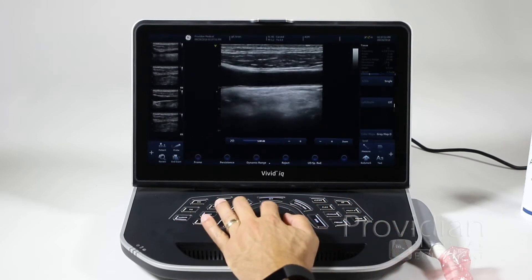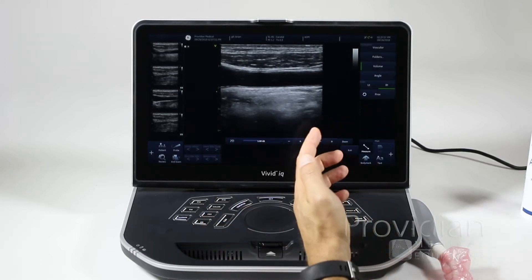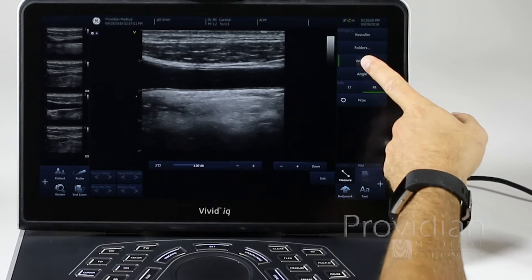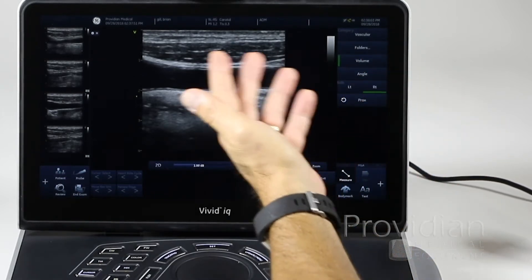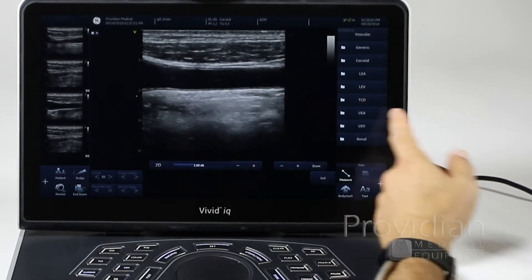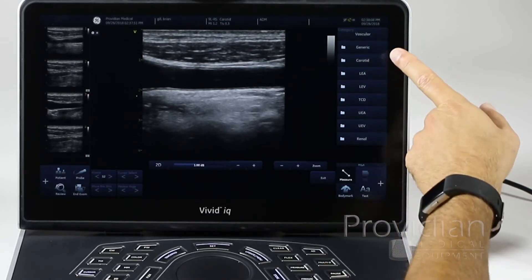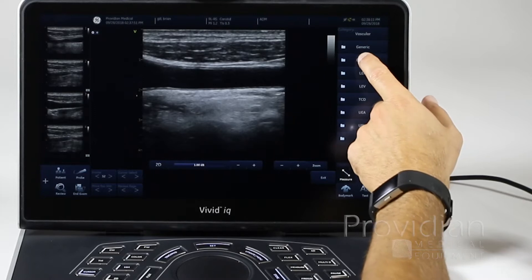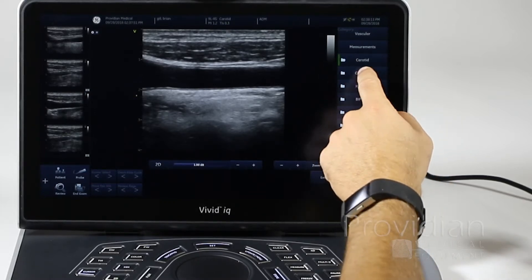I want to scroll back and get that. I'm going to click the measurement here. I have vascular folders — this is basically very straightforward. Under vascular folders, I can choose carotid, lower extremity artery, and all these different things. I'm going to go ahead and select carotid.